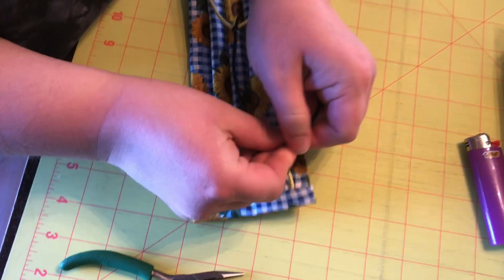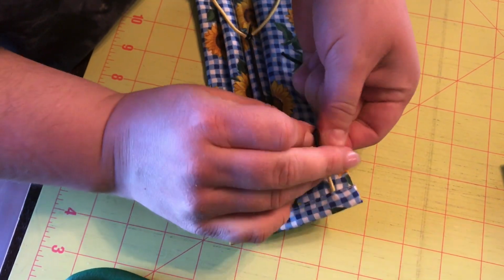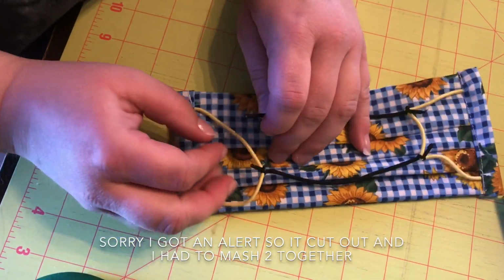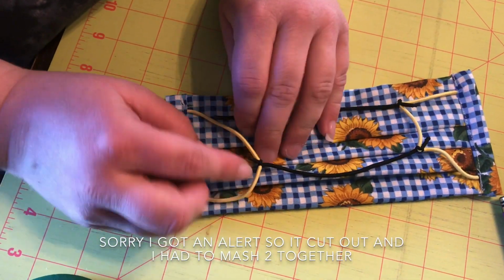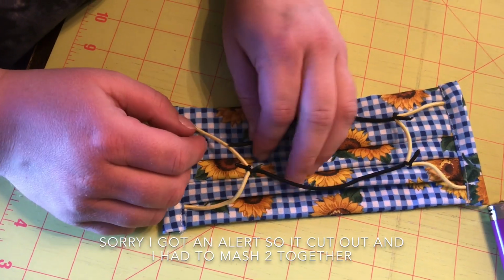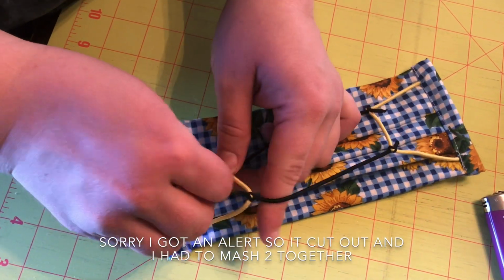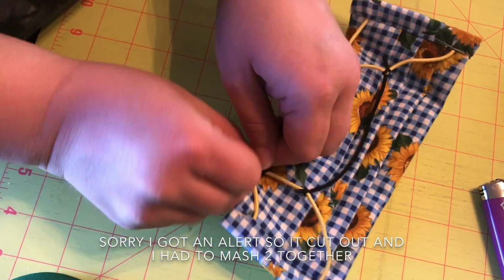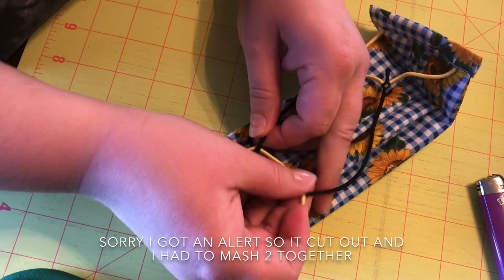So I'm gonna be putting these in the bags with the masks for everyone, for you guys to do your DIY. Okay. So I already had done these ones, but I just wanted to show you how to tie on this additional string to help to relieve the pressure from behind your ears. We found that adding the 4 of them helps.